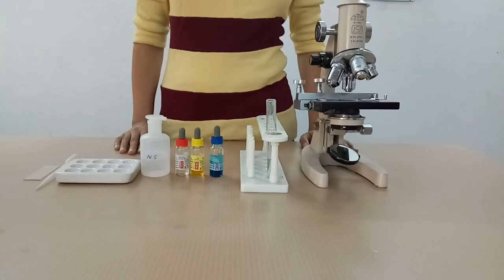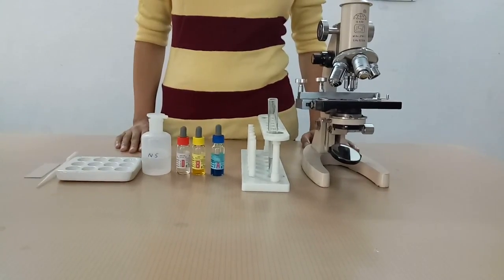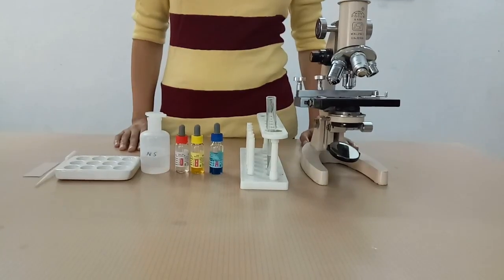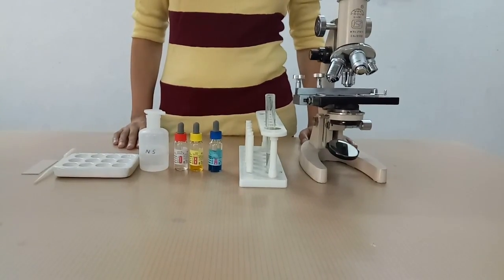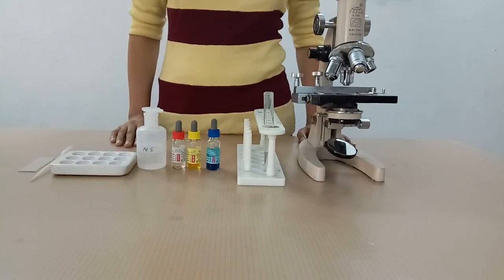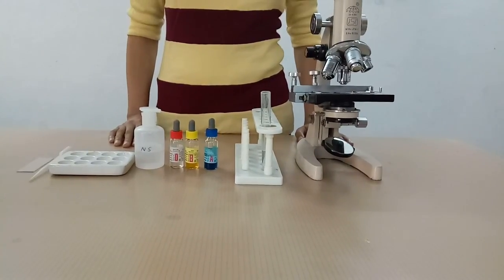There are more than 30 blood group systems. The ABO system is the most important of all blood group systems due to presence of natural A and B antigens in the individual, present on the RBC, and lack of corresponding antibodies in the plasma. So here we will perform blood grouping by ABO and RH system to determine presence of different antigens.